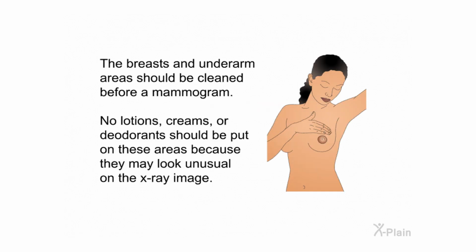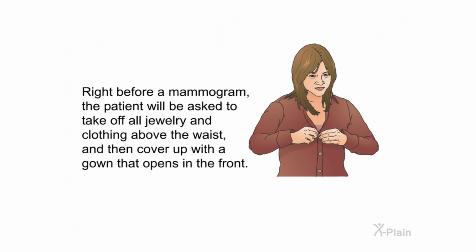Procedure. The breasts and underarm areas should be cleaned before a mammogram. No lotions, creams, or deodorants should be put on these areas because they may look unusual on the X-ray image. Right before a mammogram, the patient will be asked to take off all jewelry and clothing above the waist and then cover up with a gown that opens in the front.